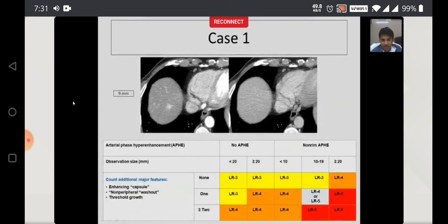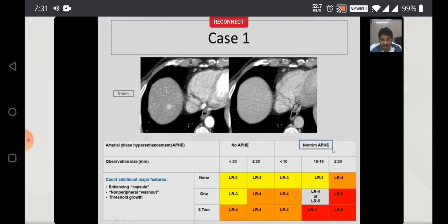Here is a case example. Arterial phase, portal venous phase, and hepatic venous phase images show a lesion around 9mm in size. This lesion shows almost complete arterial enhancement — non-rim type arterial phase hyperenhancement. Lesion size is 9mm. It does not show any washout or capsule — so additional major features are none. Most likely it is going to fall into the LIRADS 3 category.